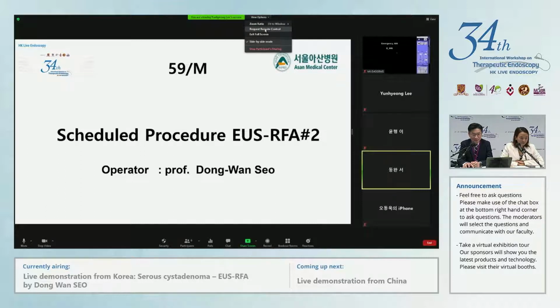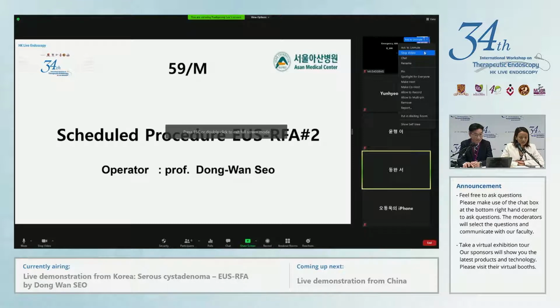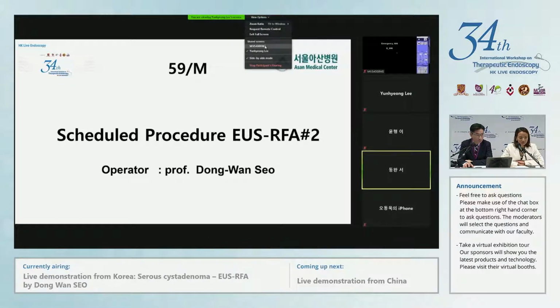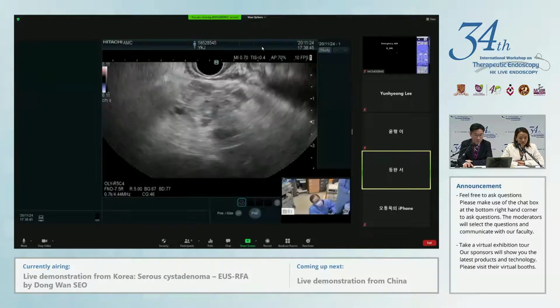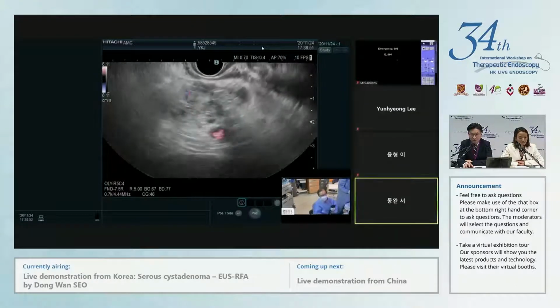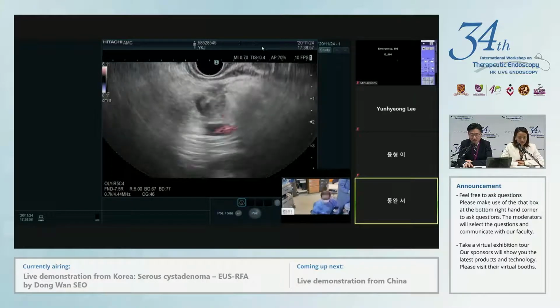It is generally believed that serous cystadenoma doesn't need to be touched because it is mostly benign. More than 99% of the cases are benign. Malignant cases are very rare. So we recommend just follow-up. But in this case, over the 10-year follow-up, the cyst size increased, and the patient became a little bit anxious. If surgery is the only option, it's better to follow this case and not touch it. But EUS-guided RFA is not like surgery. You do not need to resect the pancreas. So we are doing a study on EUS-guided RFA evaluation of serous cystic neoplasm.